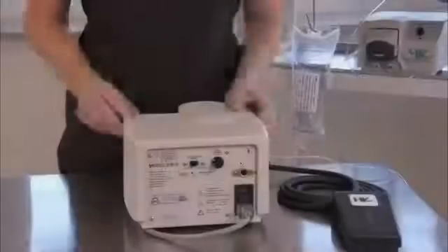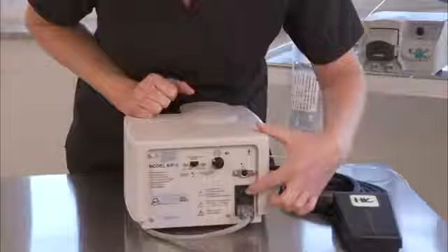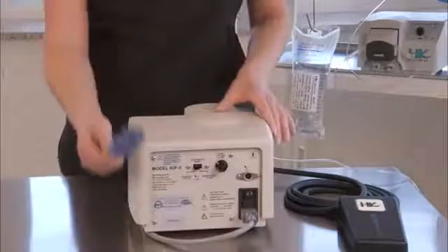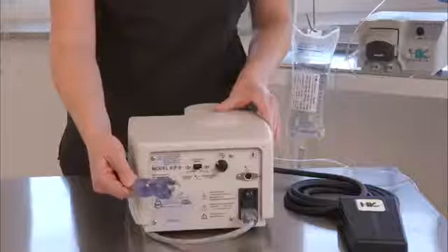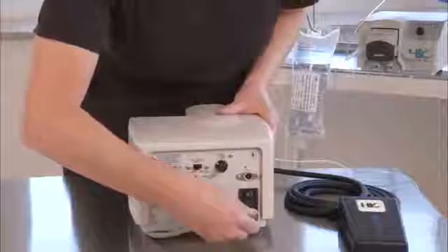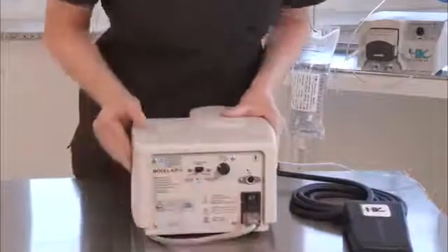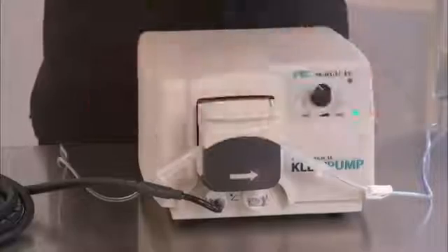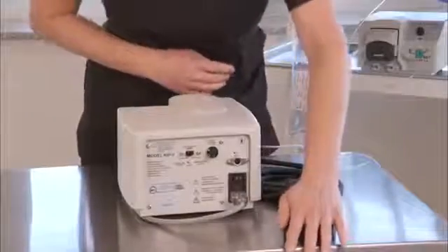Solutions: turn the power switch to on. Make sure the power cord is plugged into an outlet. Make sure the power cord is plugged securely into the back of the unit. Properly close the pump head lid. Depress the foot pedal.